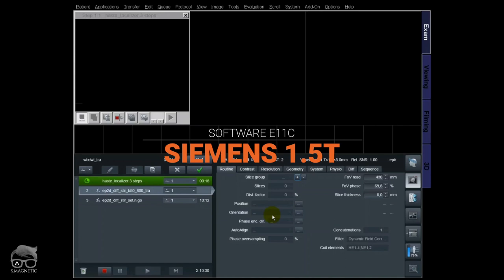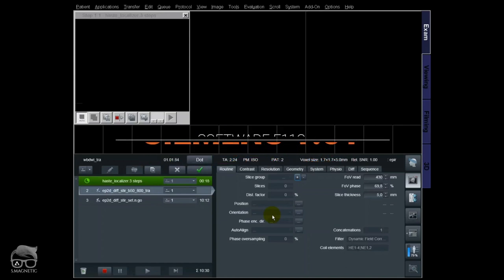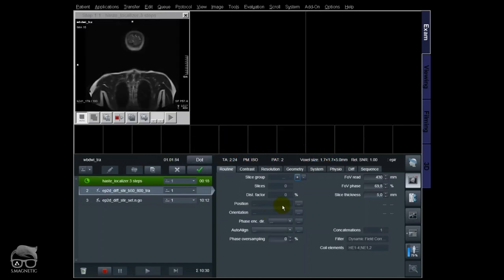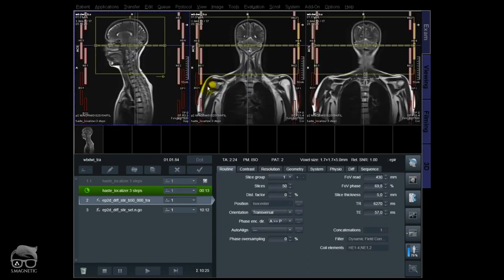We are at 1.5 Tesla, but this can be done on 3T as well. I'll start out with the localizer here, which covers from the top to the hip. This is where I'm going to stop today — I'm not going to do the whole body from top to toe, only to the hip.